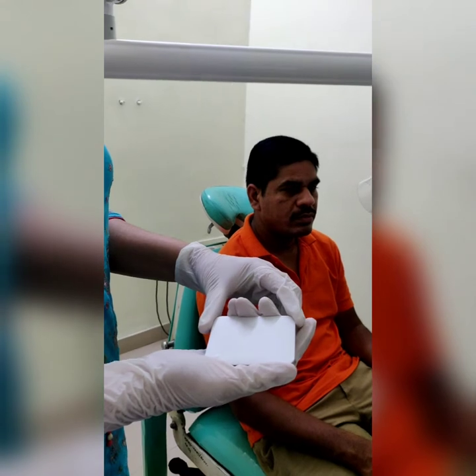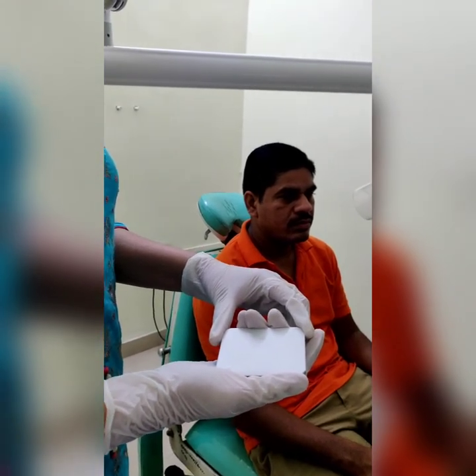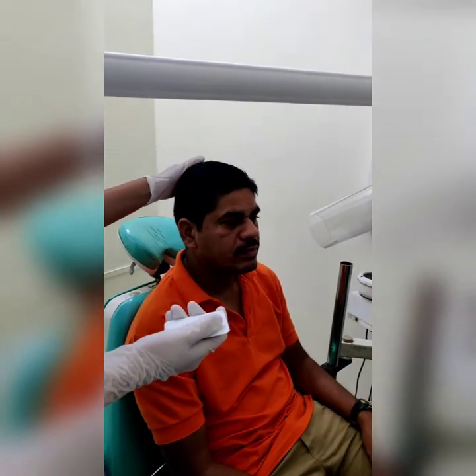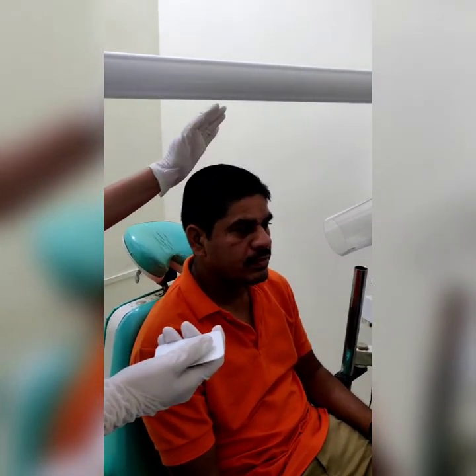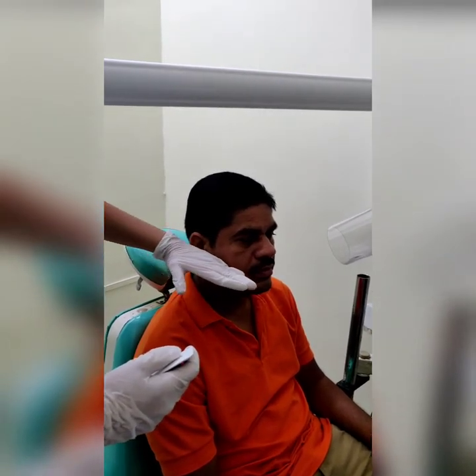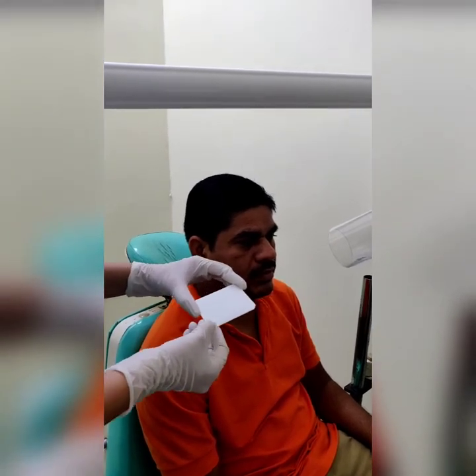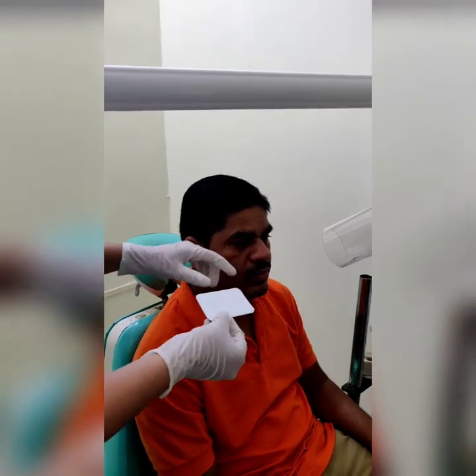First, we will demonstrate the anterior maxillary occlusal radiograph. In this radiograph, the patient's head is positioned such that the sagittal plane is perpendicular to the floor and the occlusal plane is parallel to the floor. The occlusal film is placed so that the occlusal dot is directed upward towards the maxillary.